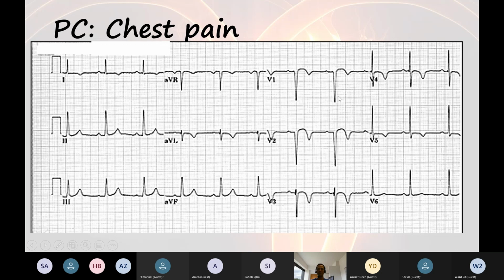So we have Q waves because we've got a negative deflection before an R wave, and they've got that in V1, V2, and we've lost a lot of our R wave. Normally the R wave would be much bigger in V3. That, together with persisting ST elevation, would suggest an LV aneurysm, and an LV aneurysm might mean that you have a thrombus in your heart because of the non-moving wall that's dilated, the sluggish blood flow in that area, so clot forms. So this is probably an old anterior STEMI. It could be a late presentation anterior STEMI, you don't know.